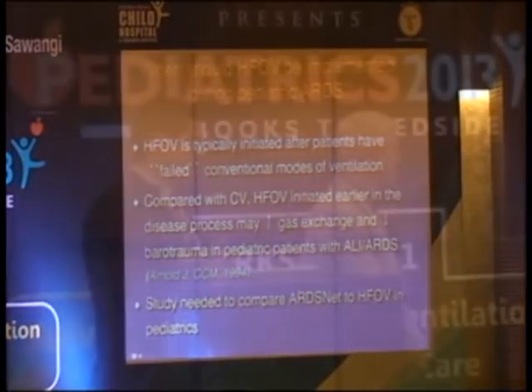There are more studies, like Jerry mentioned before, that need to be conducted: prospective randomized controlled trials that enroll patients to best practice conventional ventilation and best practice high-frequency oscillatory ventilation. You guys did a wonderful job for this part, and I want to thank you.